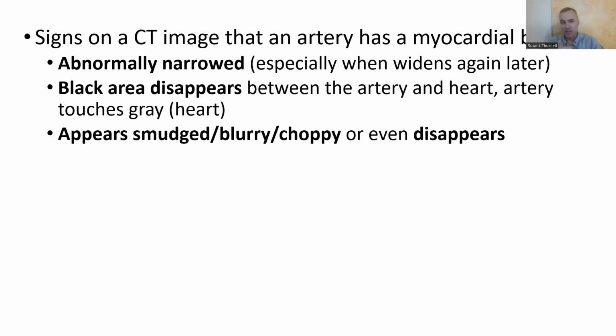And I had another surgeon tell me that I didn't have a myocardial bridge, even when he was holding the CT that you just saw in his hand. So even though it's not that complicated, it can be tricky, but the basics are there. We should realize that not everybody in a lab coat knows how to do this just because they went to medical school, because a lot of times the coverage of myocardial bridges in medical school is like 5 minutes, 10 minutes in a lecture, a paragraph in a book, and that's it.